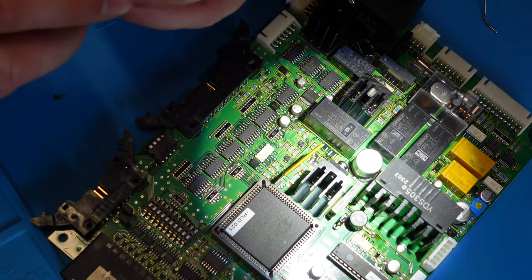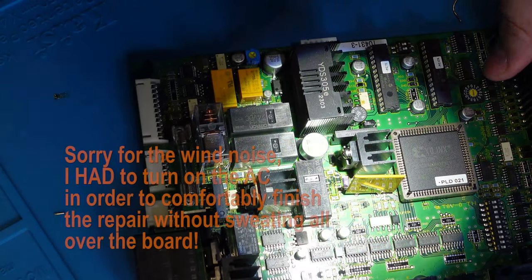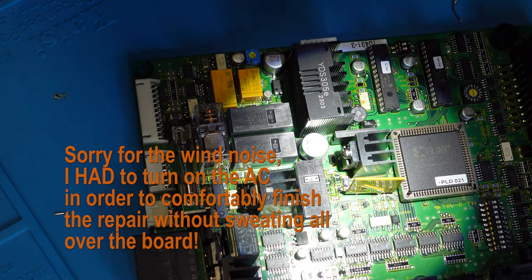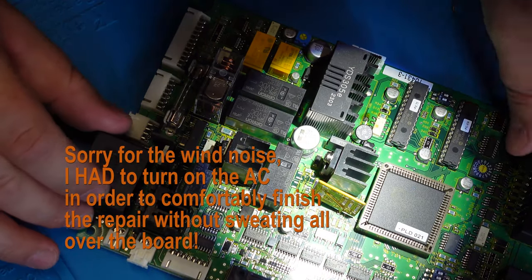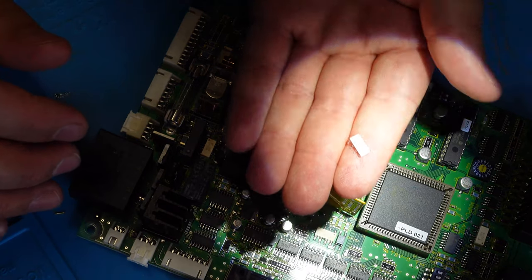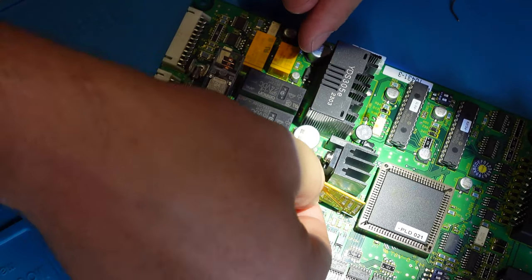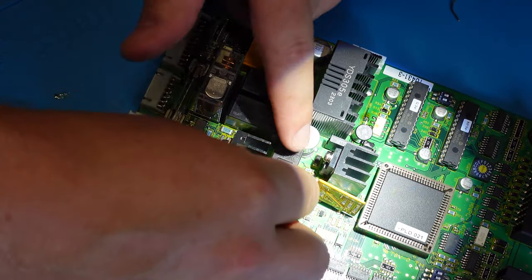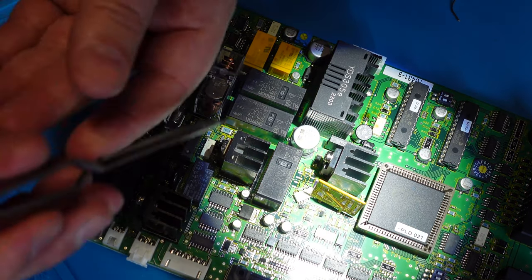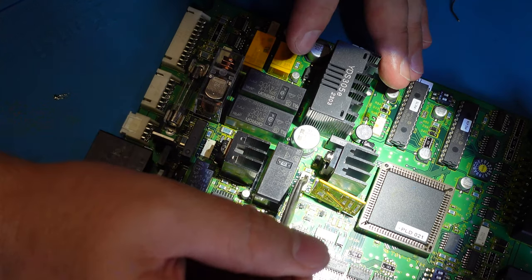Next is going to be the 8-pin photo solid state relay. Okay, next is going to be another unique trick. So right here is the area that I have to work with, and this is the chip that I'm going to put down there. So let's see how well this works out. I gotta very carefully put it down. So pin one is facing the blue. Let's try this with the tweezers. Right there.